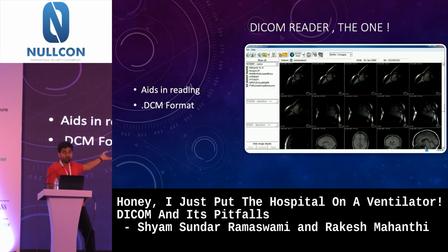Instead of going back to the whiteboard, if you observe, you go to a hospital, you'll see the doctor getting everything on his desktop, right? Once the scan is done, it automatically comes to him. DICOM viewer helps you to view these things.